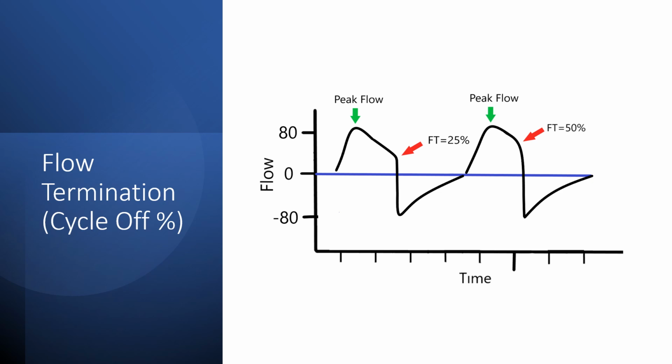Now, in my experience, I feel like rise time is more effective or more helpful. I can't explain it to you. I'm just telling you that in my experience, that's what I've seen. There is some evidence to show that adjustments of 25 to 50% don't make a huge difference in patient synchrony and compliance. But again, there's no harm in doing it. You're not out anything. It's easy to adjust.